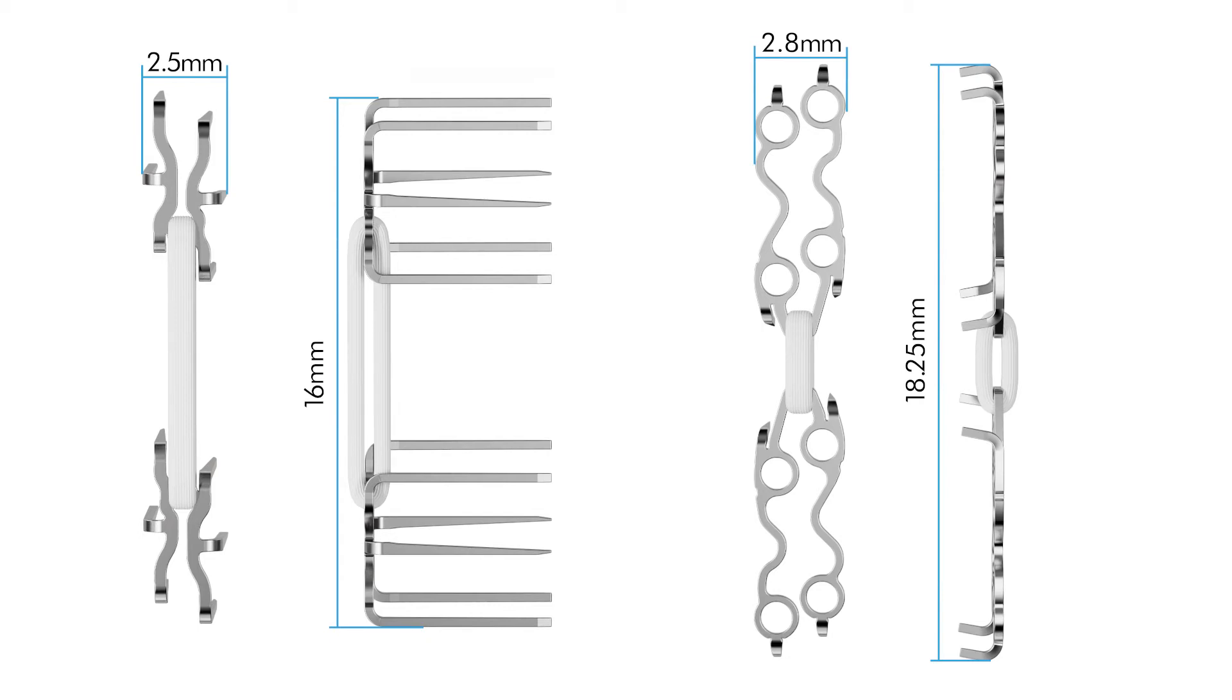The top component is 16mm long and 2.5mm wide. The bottom component is 18.25mm long and 2.8mm wide.